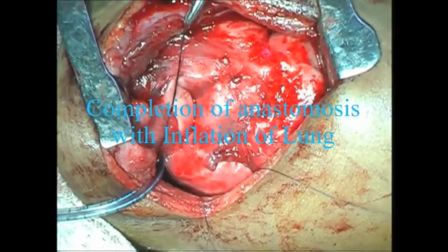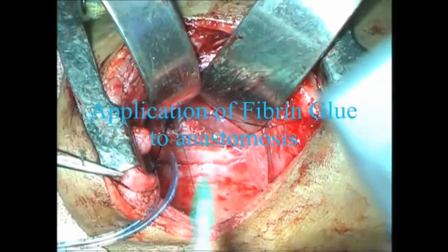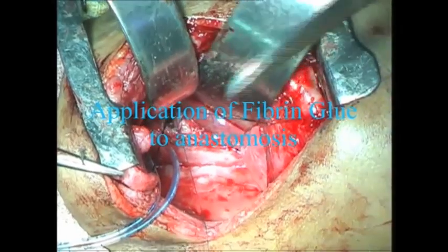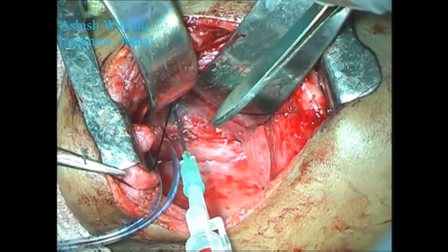And here we can see that for the first time the right lung of the child is inflating as the anesthetists compress the airway bag.